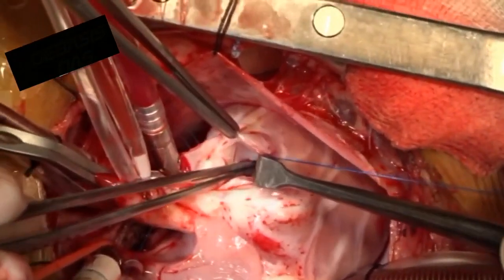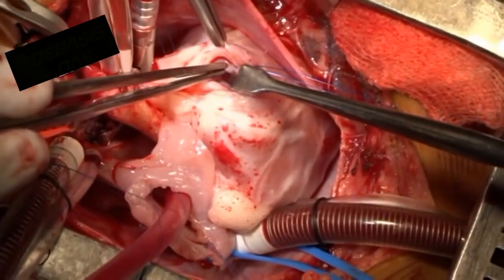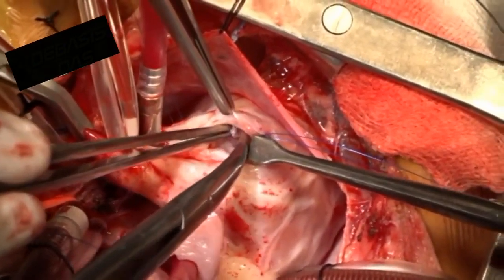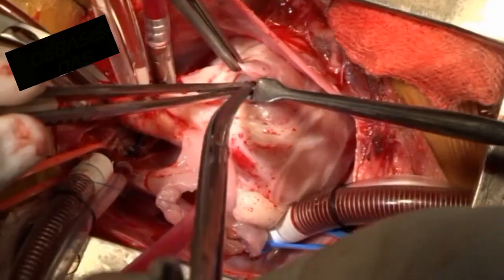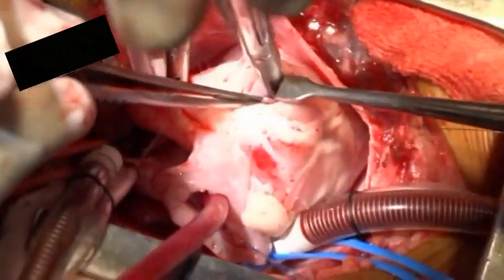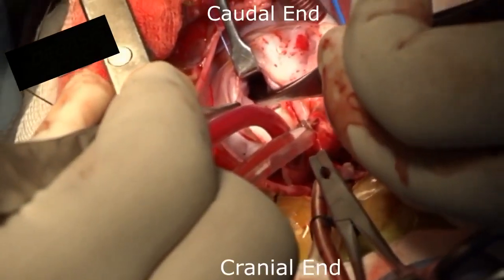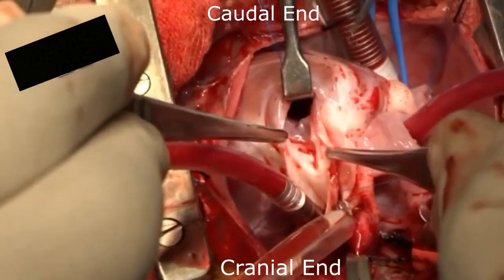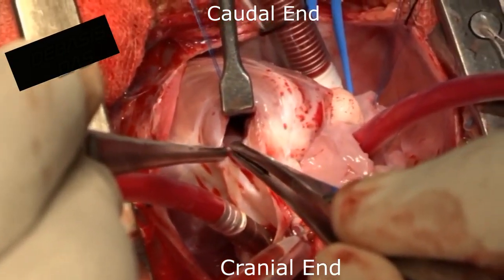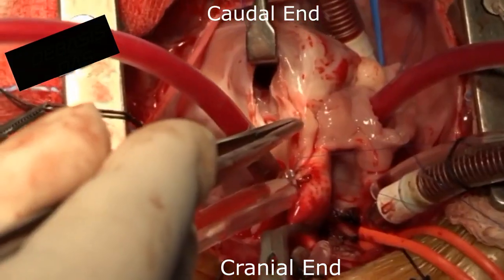The ventriculotomy is extended. Any further muscle bundles are then resected through the ventriculotomy. It is also important to limit the size of the ventriculotomy to a minimum to avoid post-operative right ventricular dysfunction. The orientation of the video has changed and you can see the cranial and the caudal end. This is the video from the top.